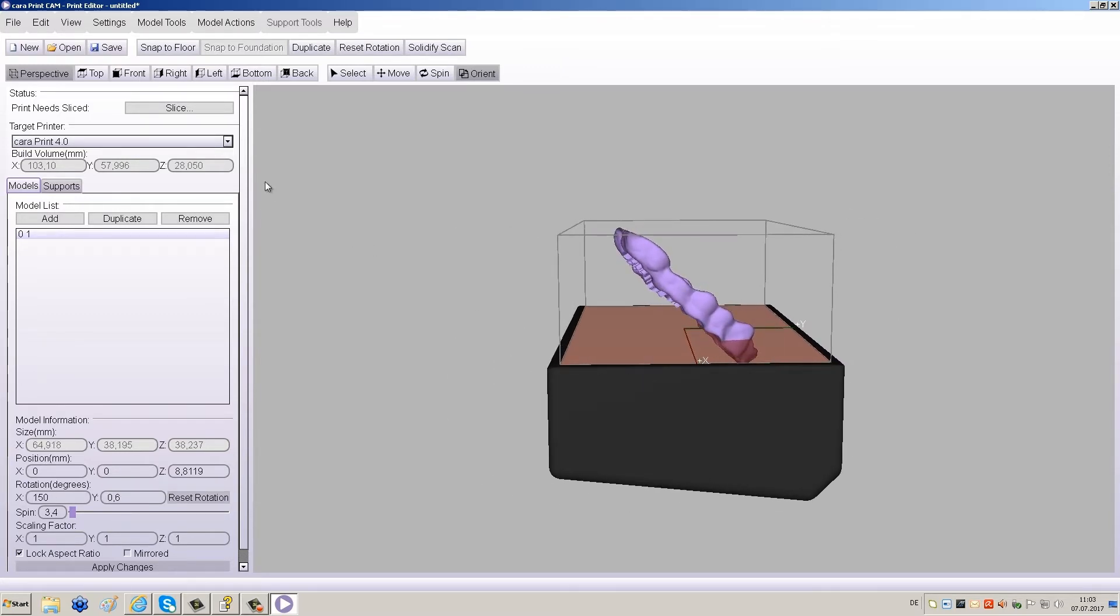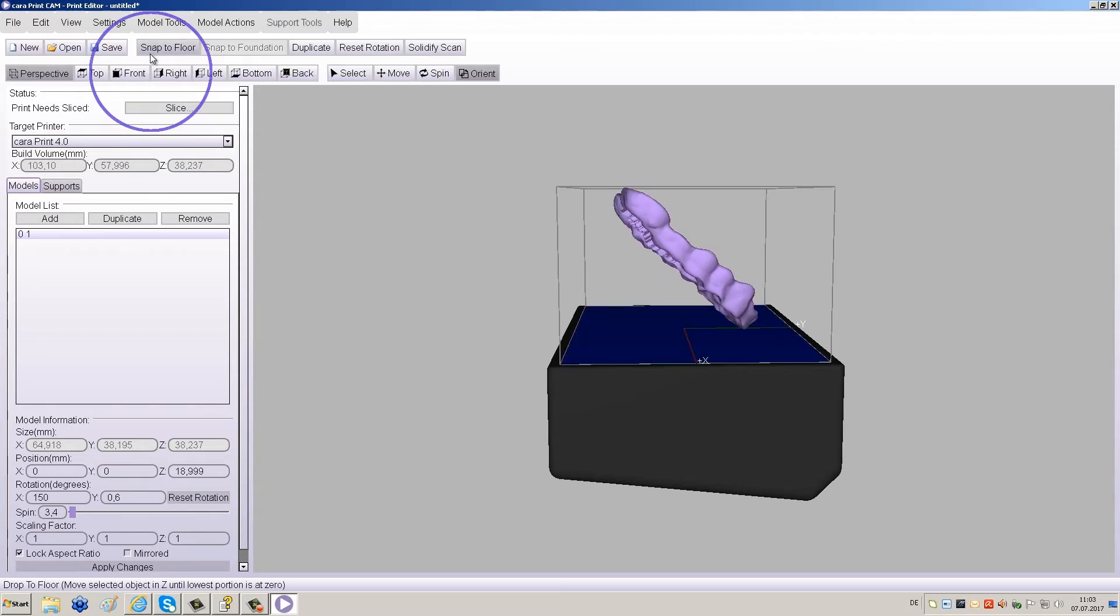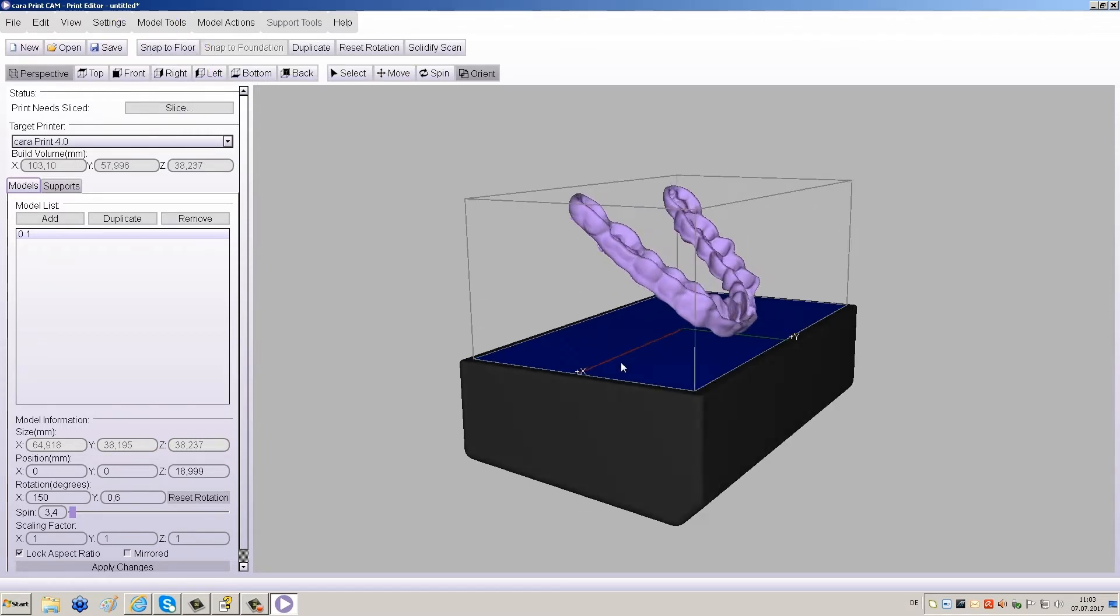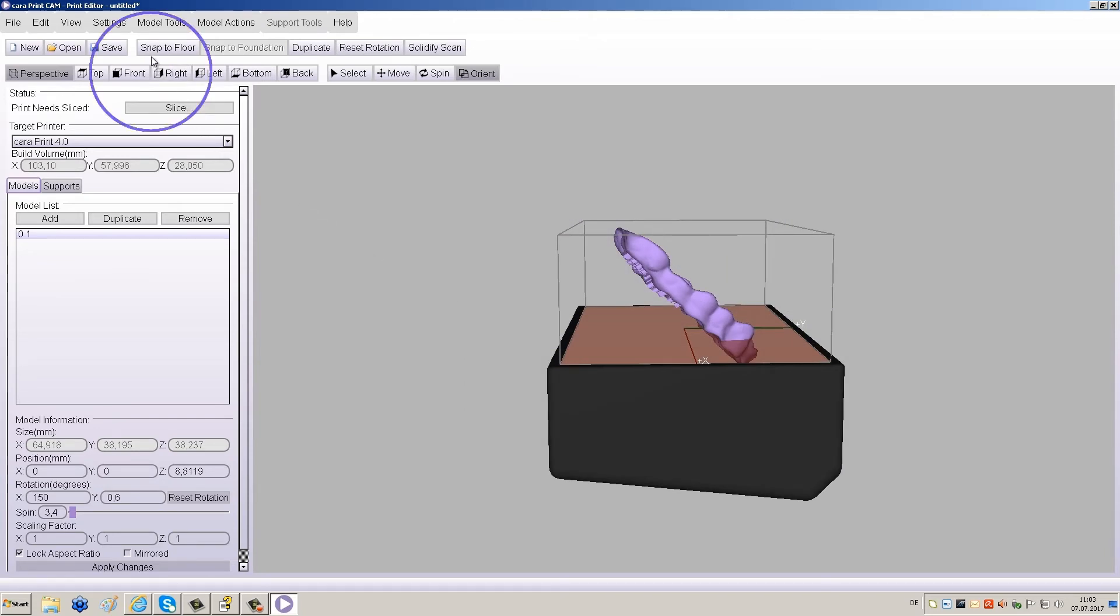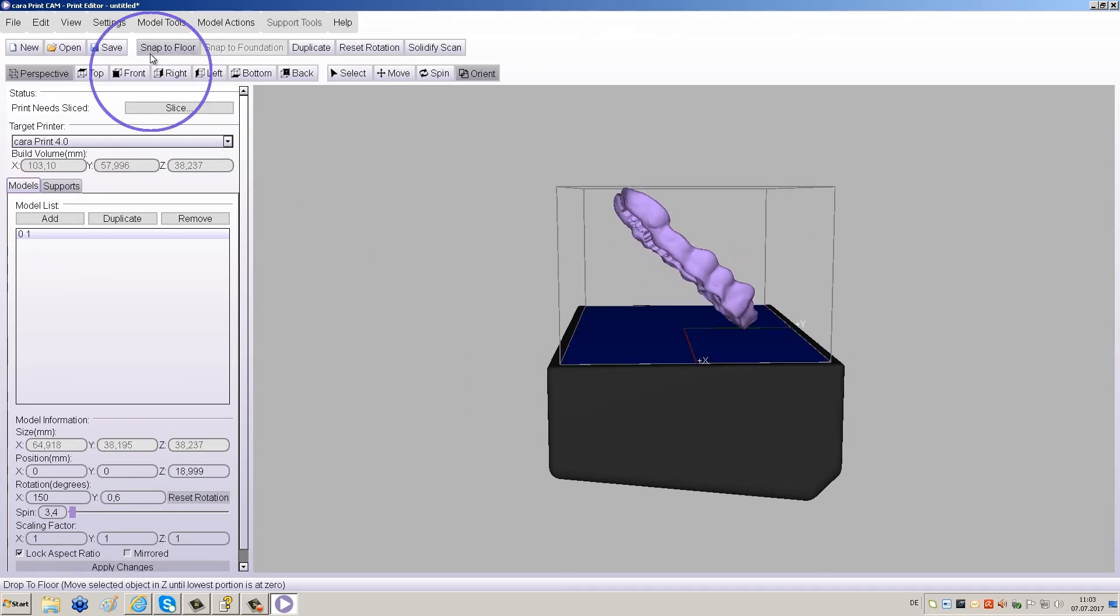To align the lowest point of the object to the building platform, click Snap to Floor. The distance between the platform and object should be about 10 to 15 mm.